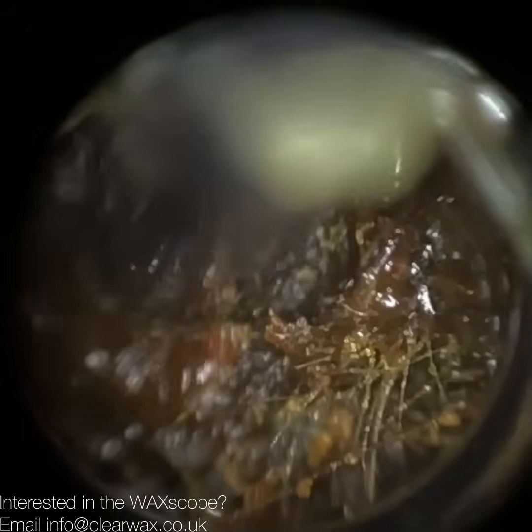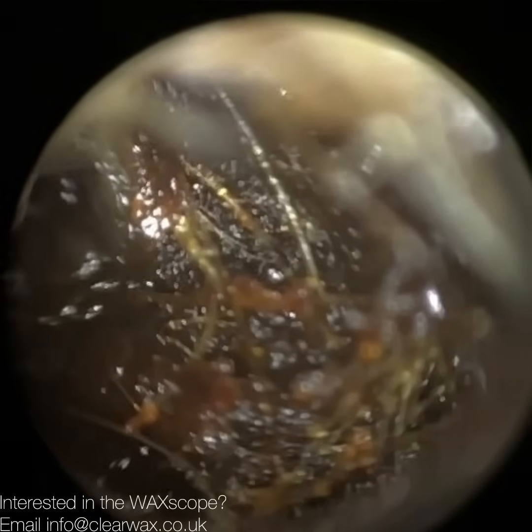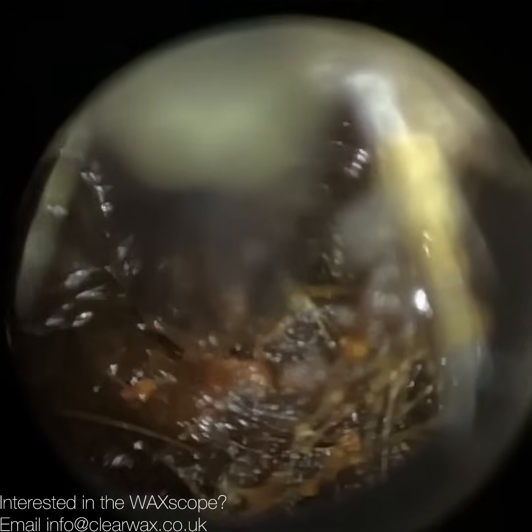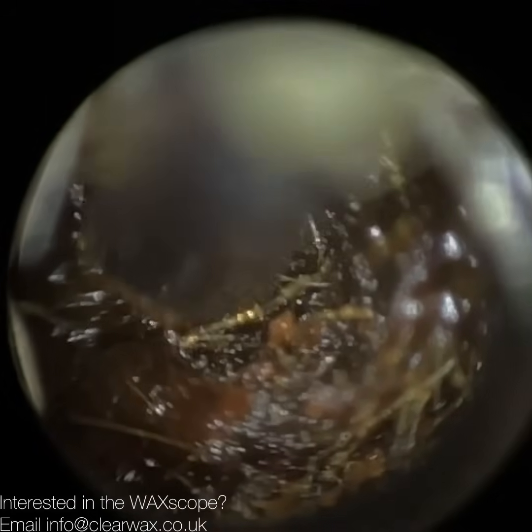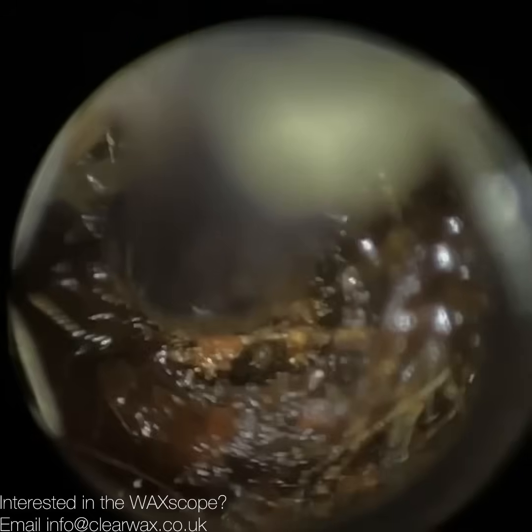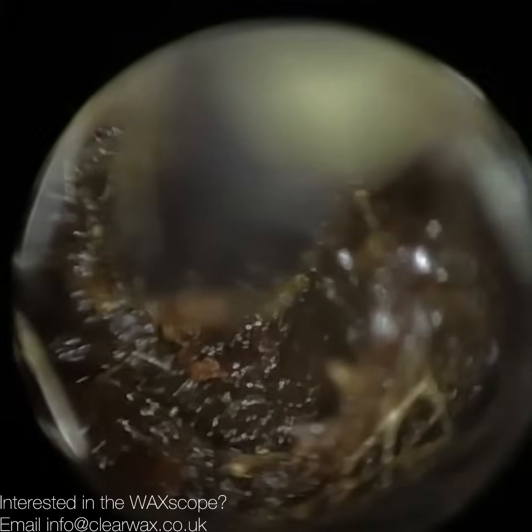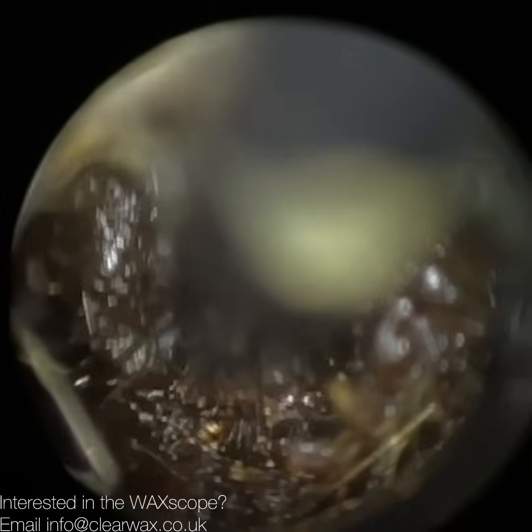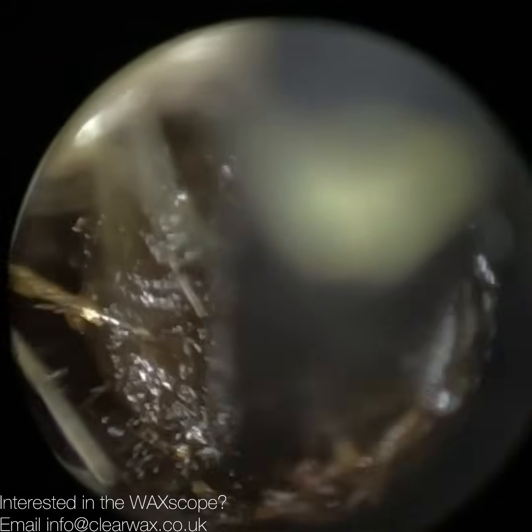We have got a larger size, 5mm for large ear canals, and we've got an extra large one for patients who have very abnormally large ear canals, and that's typically post-surgical. So if the patient's had a mastoidectomy, where the mastoid bone is drilled away, I should call it a canal wall down mastoidectomy. The mastoid bone is the bone behind your ear. You can actually feel part of it if you place your finger behind your auricle, your pinna, which is the flap of cartilage on the side of your head. You can feel the flat surface. That's the mastoid bone. That's an air-filled bone.